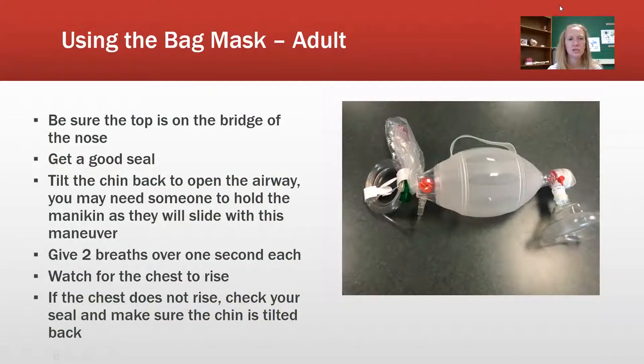The next section is using the bag mask — we have the Ambu bag mask. The first thing is making sure that the bridge of the nose is on the nose part; that's a mistake I've seen students make quite a bit. Make sure you get a good seal with a C-clamp to ensure the mask is sealed correctly over the nose and mouth so you don't have air coming through. Give two breaths over one second each and watch for the chest to rise. If it doesn't rise, check your seal and make sure the chin is tilted up.